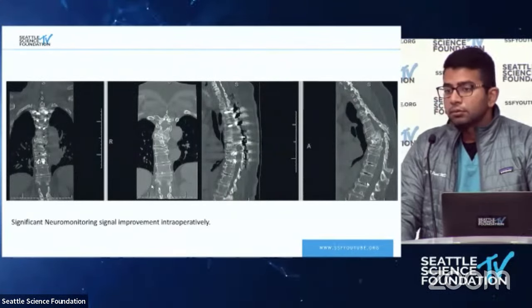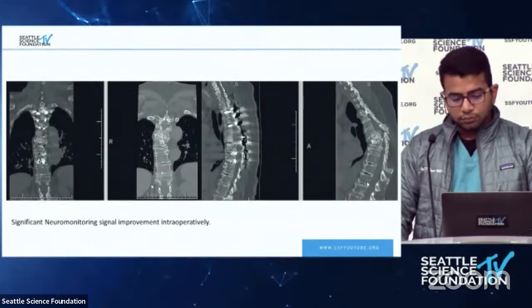I like the cemented screws. How often, Dr. Chang, do you use cemented screws now? I think, as Rod mentioned, we see a lot more of these vertebra plana type fractures, so pretty much always in those cases. Typically, for more of an elective case, I try to optimize their bone health beforehand with some anabolic agents. So maybe in those cases you don't have to if the bone stock is better. But definitely for any of these vertebral insufficiency fractures, if you're going to treat them surgically.